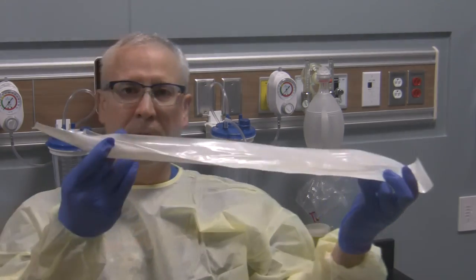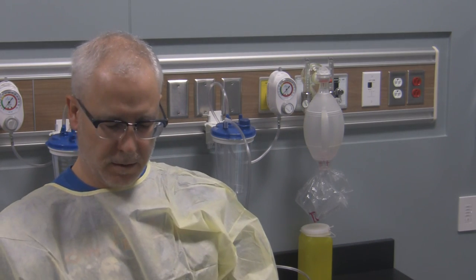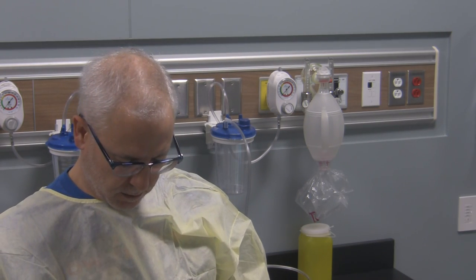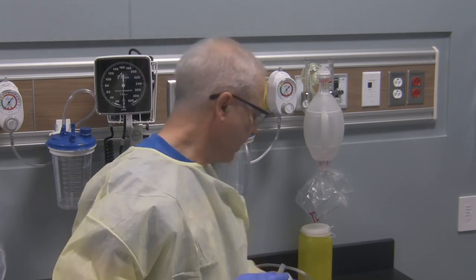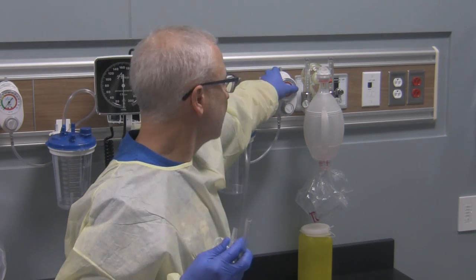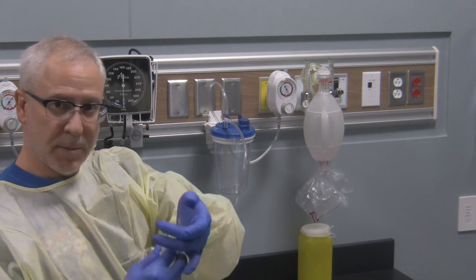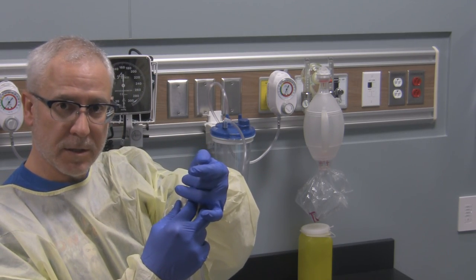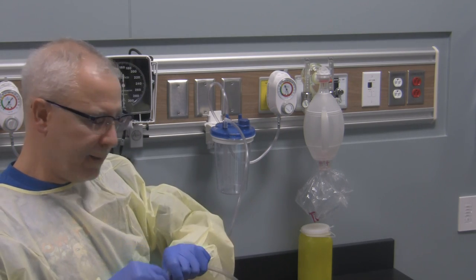Now let's get the equipment set up. I'm going to take my suction catheter — this is a 12 French — and open it up. Before I connect it to my suction source I want to ensure the suction is working. I'm going to turn it to full line pressure, which is registering on the gauge. I'll plug it off at the point closest to the patient and confirm full line pressure, then connect it up.